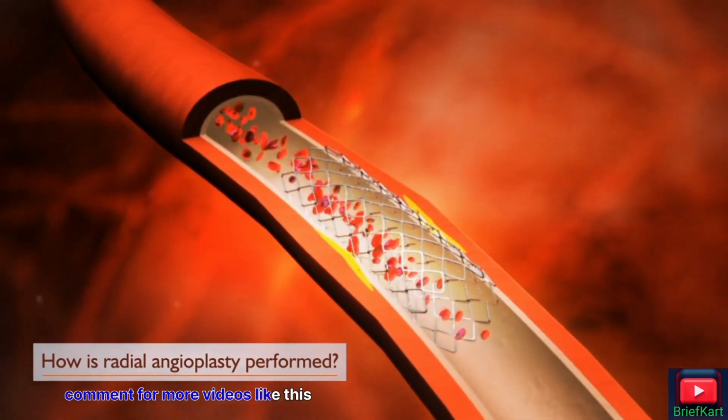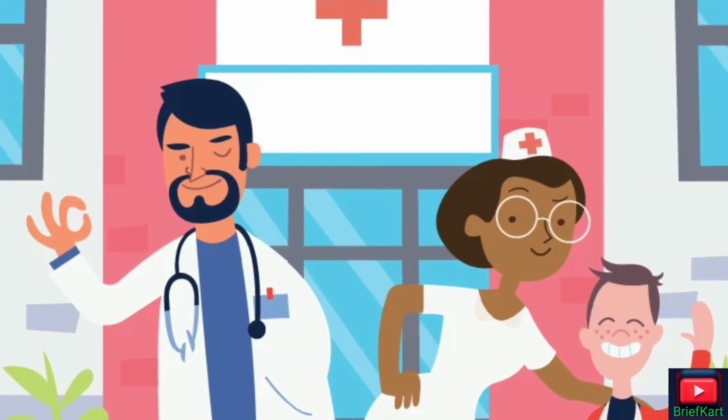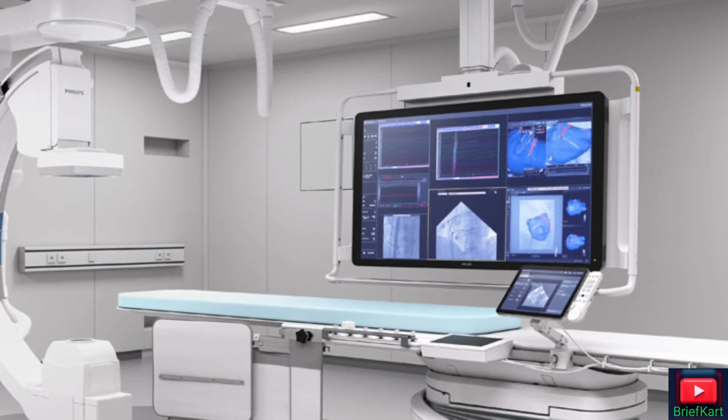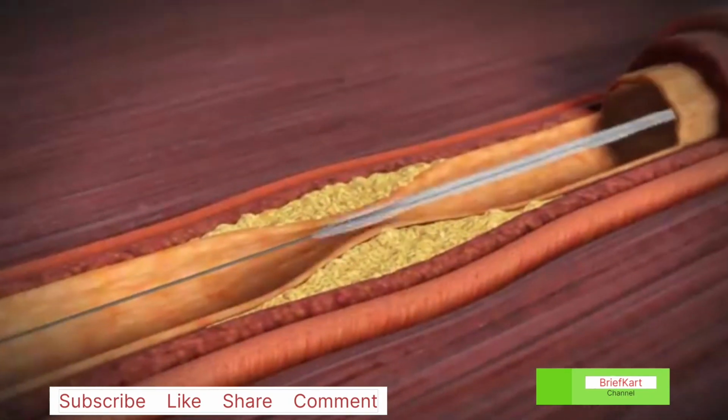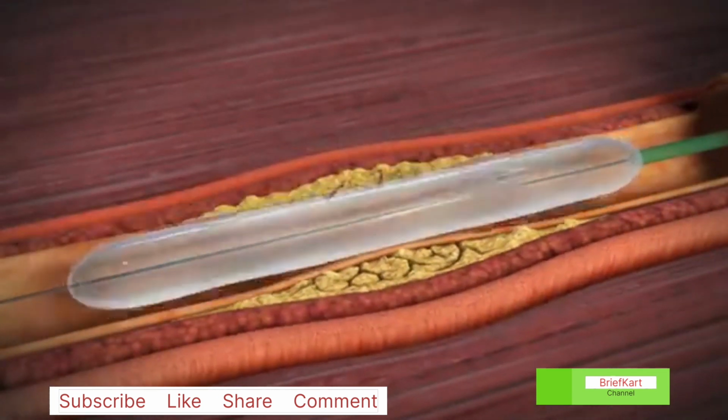The invention of the system surely relieves patients from calcified coronary disease and supports the treating cardiologist in a difficult angioplasty procedure. I think you have gained the most valuable information about the treatment of coronary disease and one of its modern technologies.